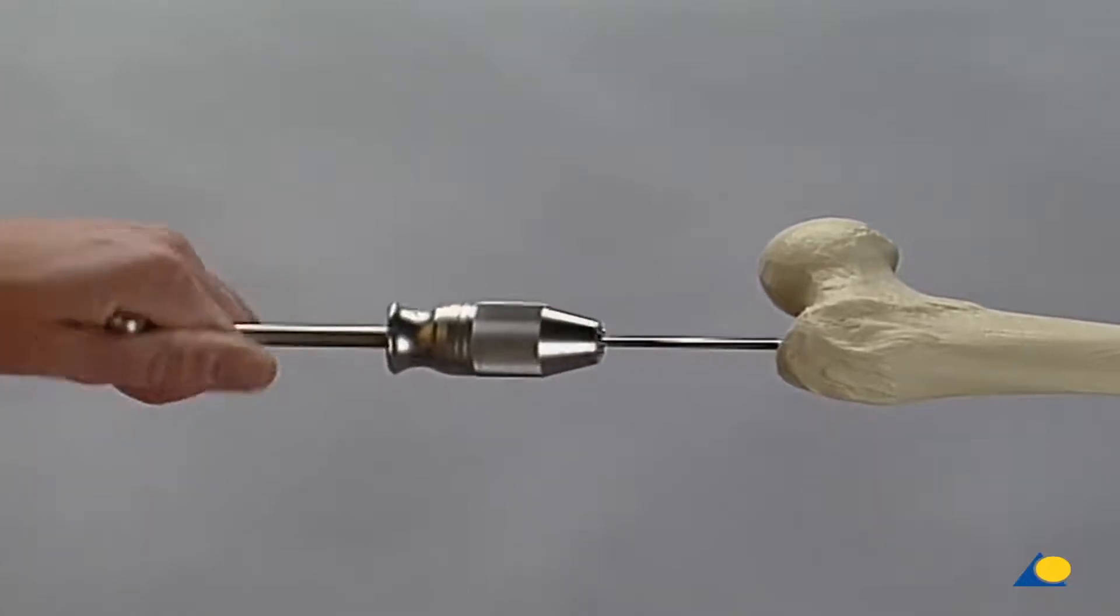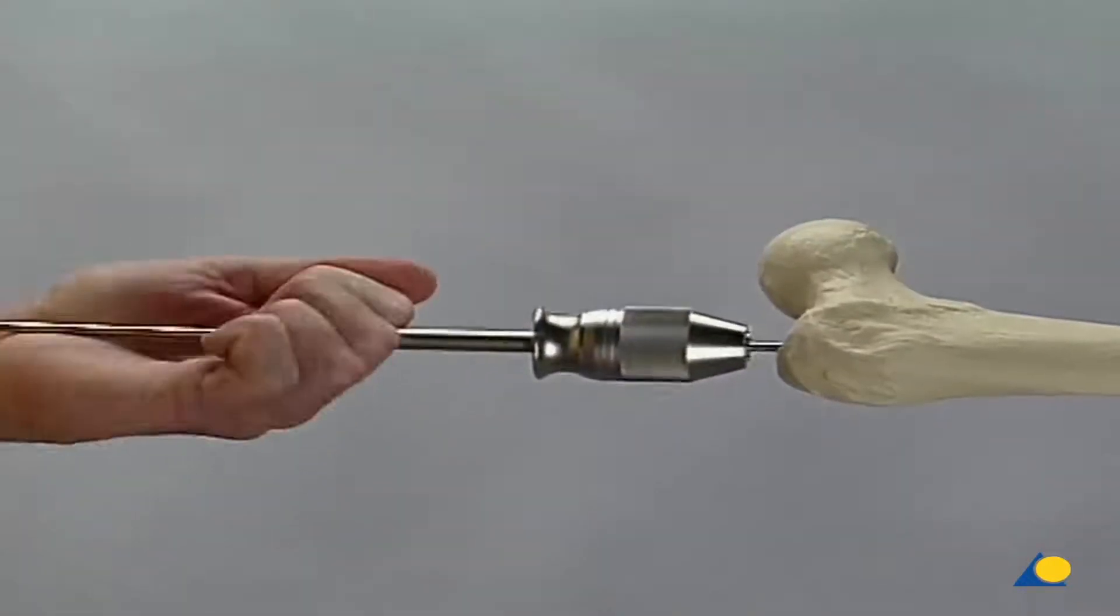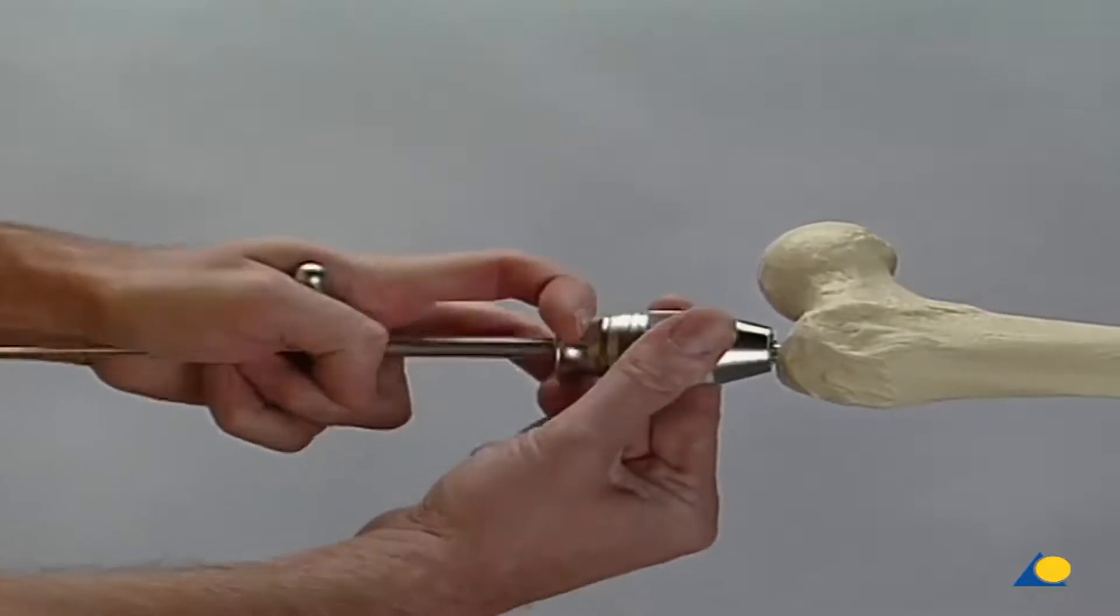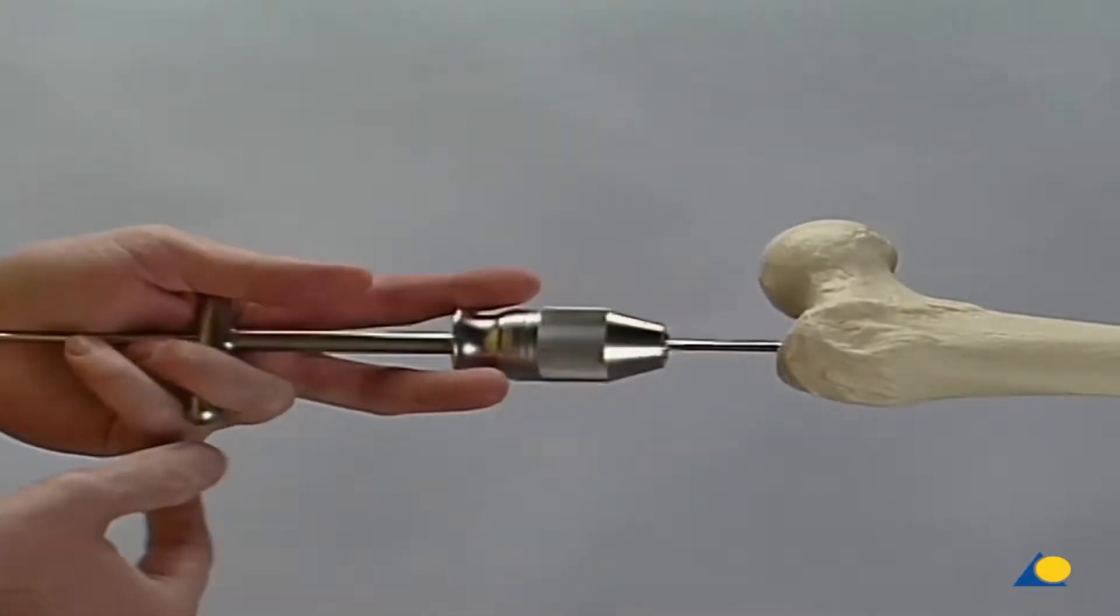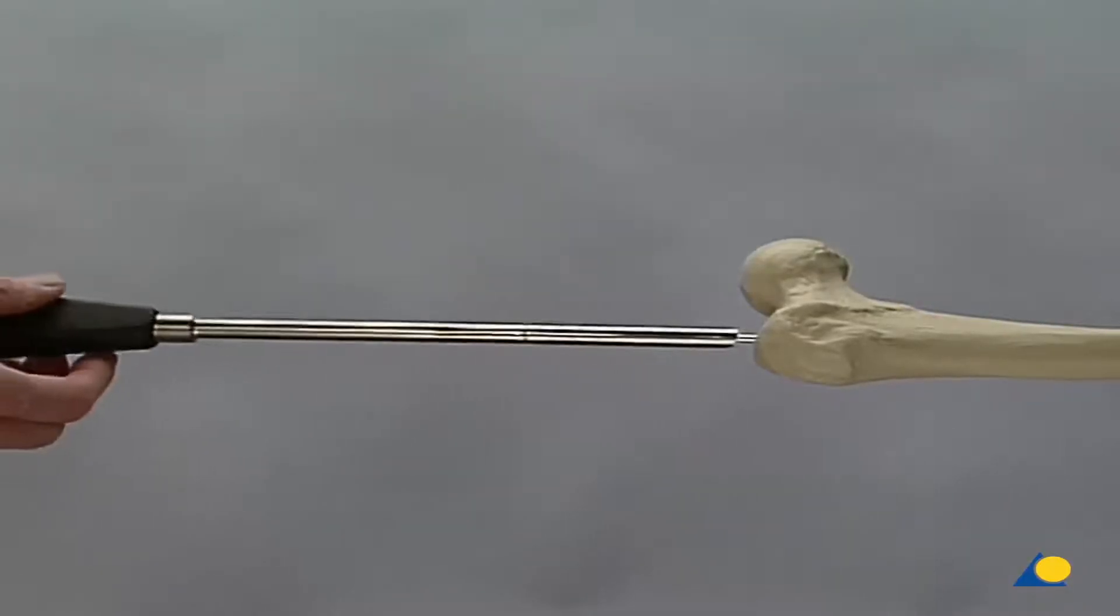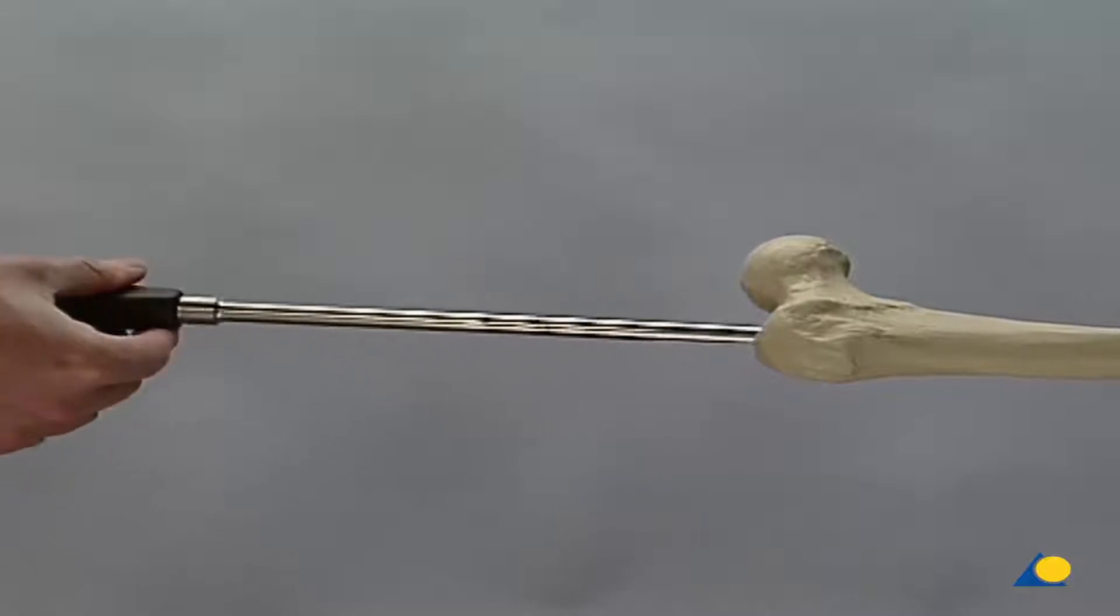The positioning of the wire must be monitored by means of image intensifier control in two planes. After the guide wire has been placed correctly, the medullary canal is opened with the appropriate instrument.